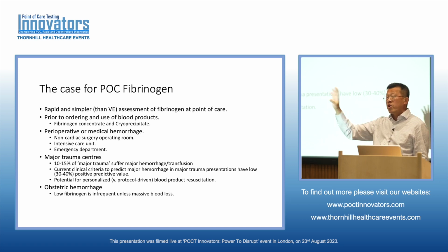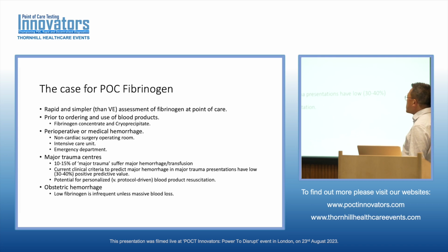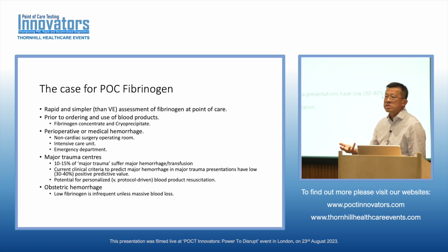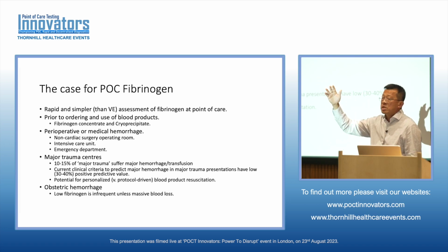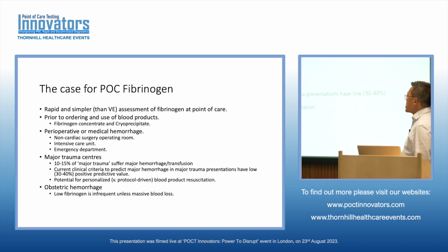Now, if you're in Wales, you're very lucky because every Welsh maternity unit has a ROTEM device, and they've had that for quite a few years now. And I guess it's the hematologists, obstetric anaesthetists and obstetricians who have really pushed forward the understanding and the management of obstetric bleeding in this country. Okay, and that's largely come from a couple of individuals, but also the fact that they've got a ROTEM in every delivery unit in Wales.